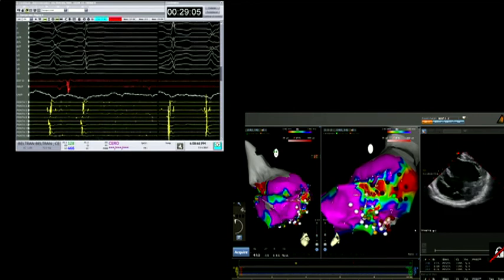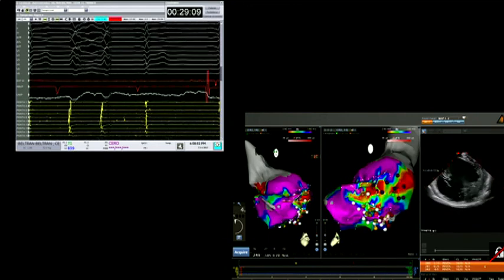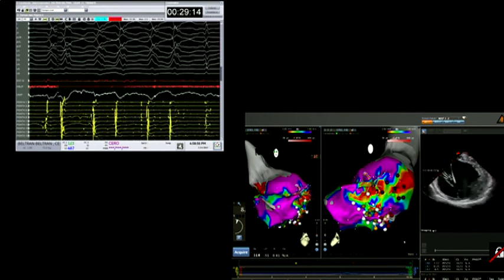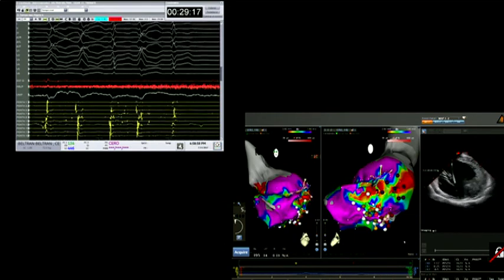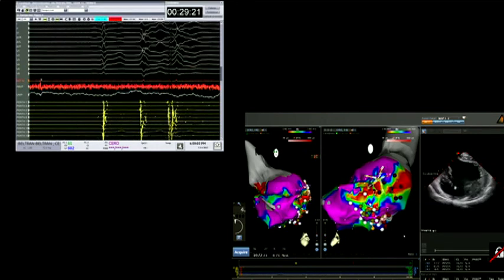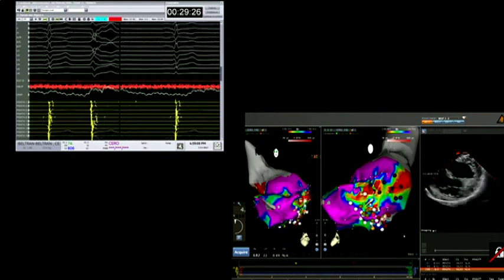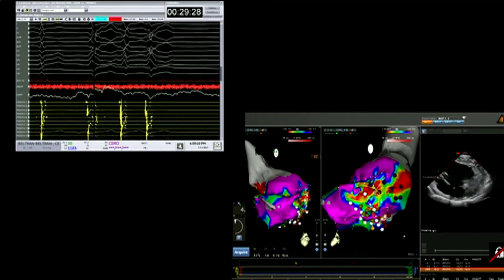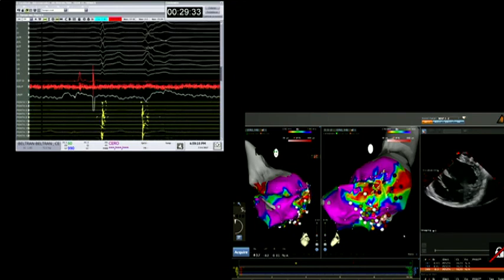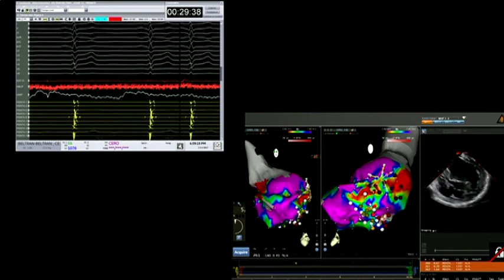Andrea, in your experience, when you are comparing the voltage map performed by point catheter, ablation catheter, against or compared from pentaray, how is the scar different? Is it bigger or smaller? Look at this, Andrea. Yeah. This complex potential we're getting is very nice. That's beautiful. You see how the pentaray is stuck right there, basal to the anterolateral papillary muscle.